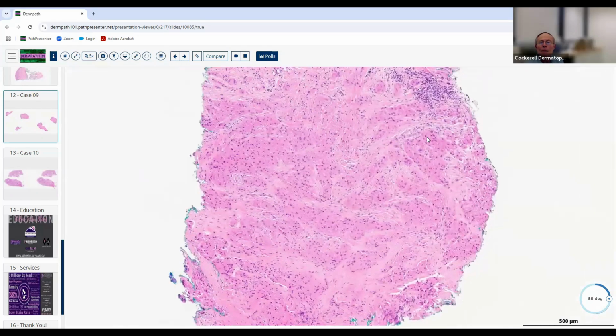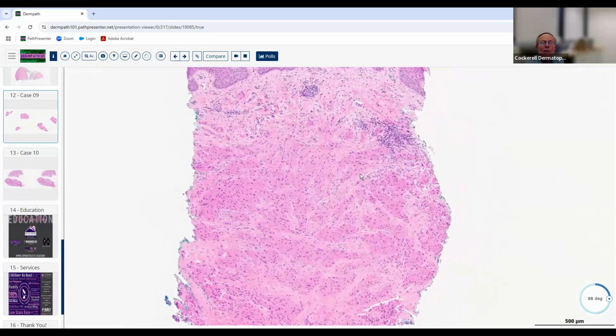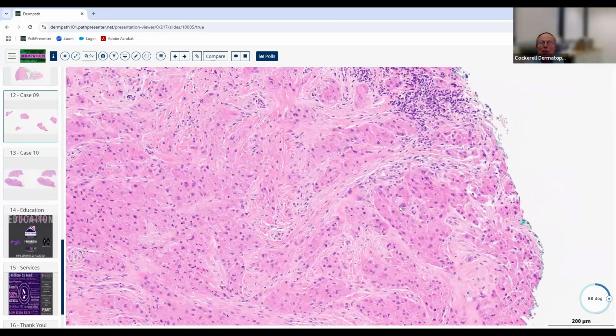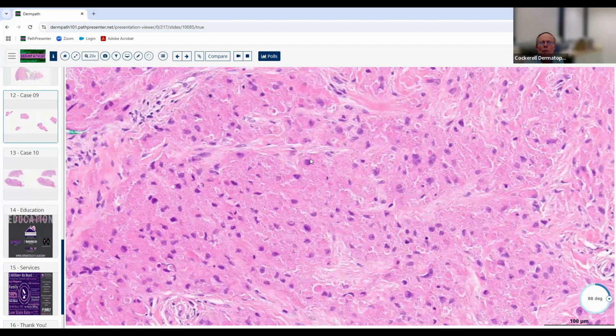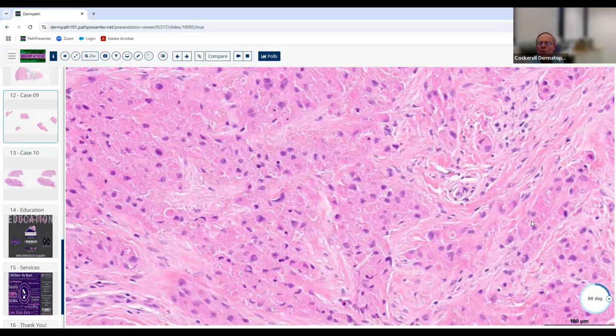So we're going to higher magnification. And now we start to see these cells arranged in little aggregations, and some of them are forming elongated aggregations here. They're not really cords and strands because they're not just single cells. They're almost forming nests in some areas. And they have this very characteristic pink cytoplasm. We're going to have to look at the cytology to see if we think that they're benign or malignant. There's really not any significant pleomorphism. The nuclei are pretty uniform. There are no mitoses. There's no real striking anaplasia or pleomorphic nature to these cells.